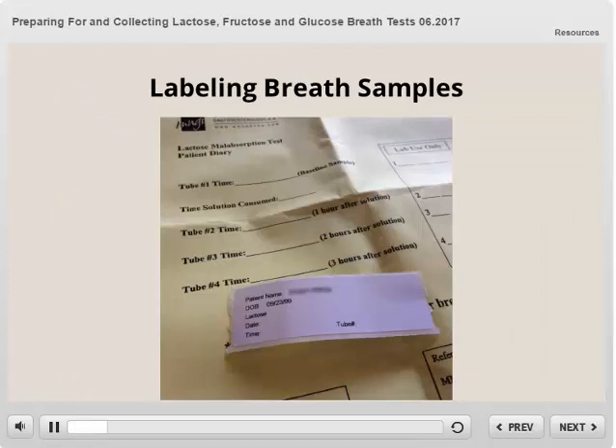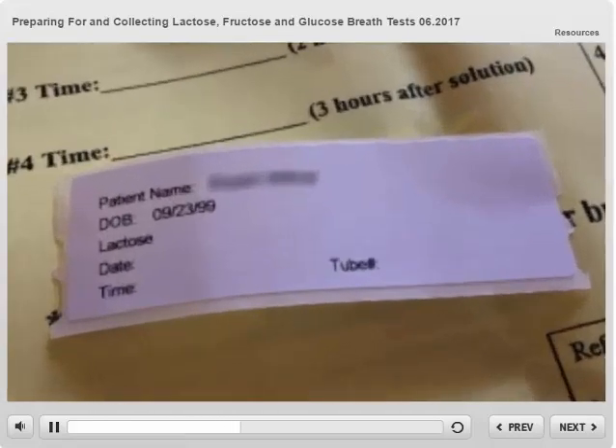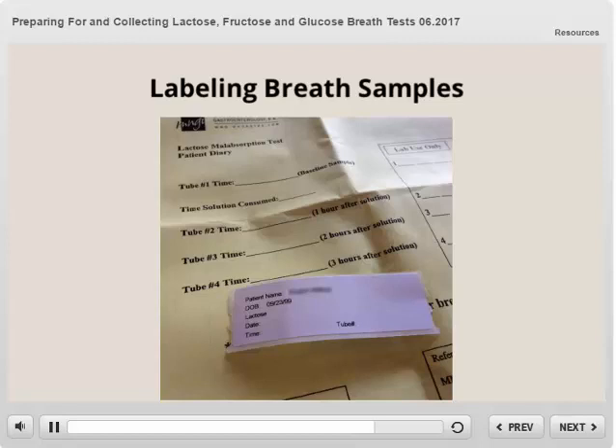Labeling your breath samples: immediately after collecting each tube, it is very important to label them. Using the printed labels, document the date, time, and the tube number in the appropriate spots, and then place the label on the tube. You will also document the time of collection on the patient diary.